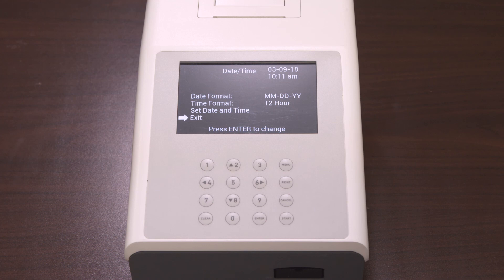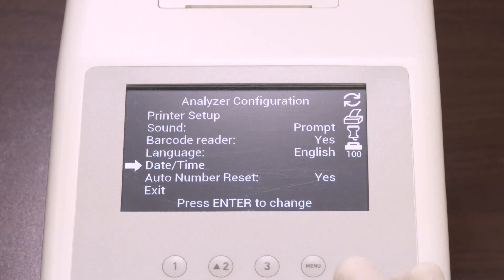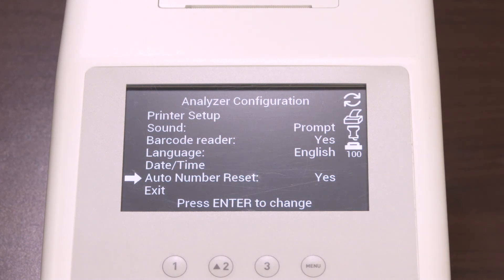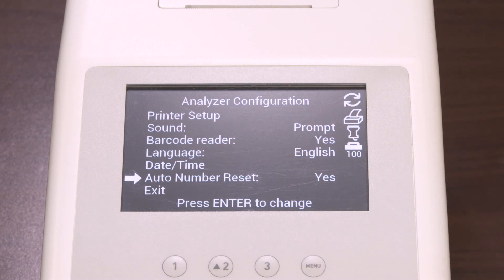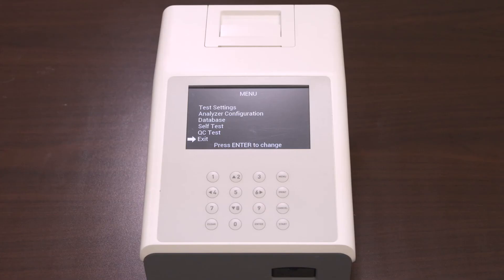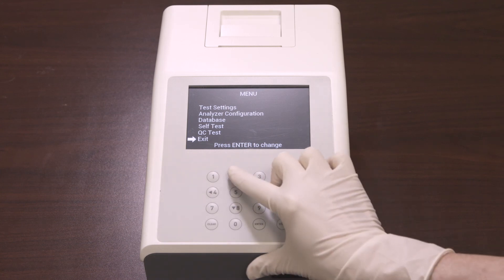Make sure the date and time setting is correct based on the date format and time format. The last option in the analyzer configuration is auto number reset. Select auto number reset and press enter to cycle to yes or no. If you select yes, the test number will reset each day. If you select no, the test number is unaffected by the date. Once you have selected your desired option, select exit to go to the menu screen.